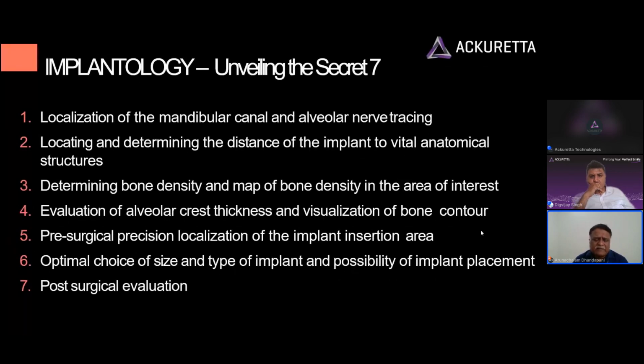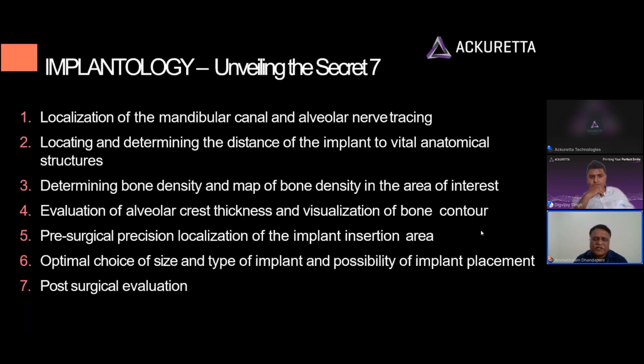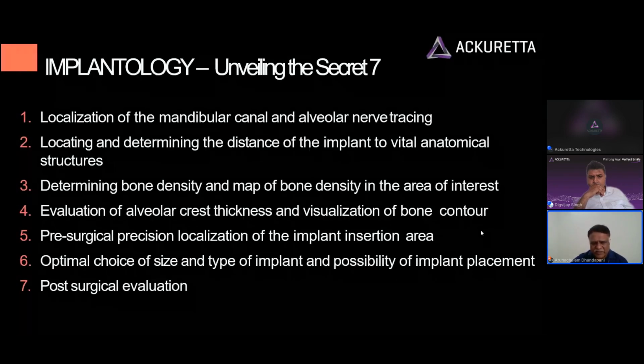We can evaluate the alveolar crest thickness, visualize the bone contour. We can precisely position the implant insertion area. We can look at it pre-surgically, precisely at the implant insertion area. We can choose the size and type of implant, and how many implants can be placed, whether it's possible at all to place an implant, and also do post-surgical evaluation.